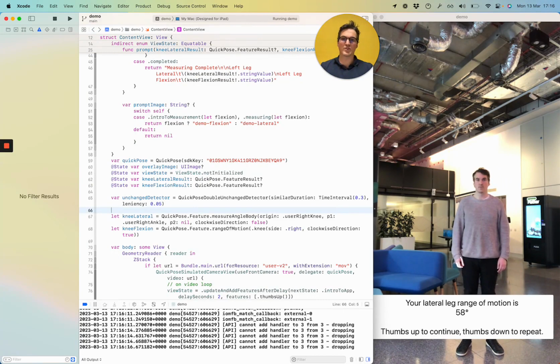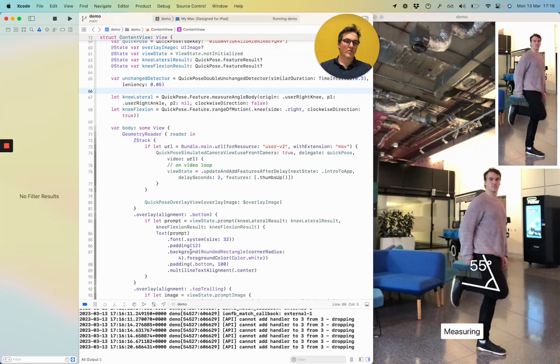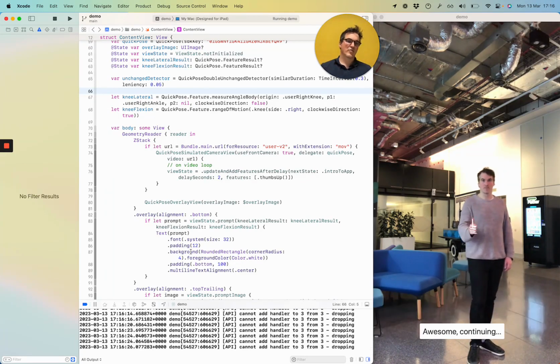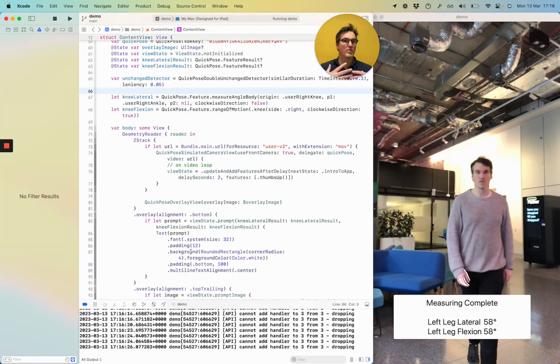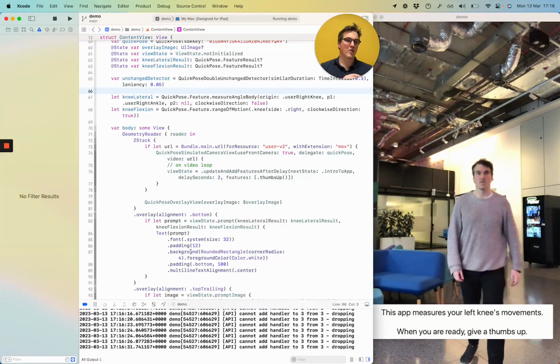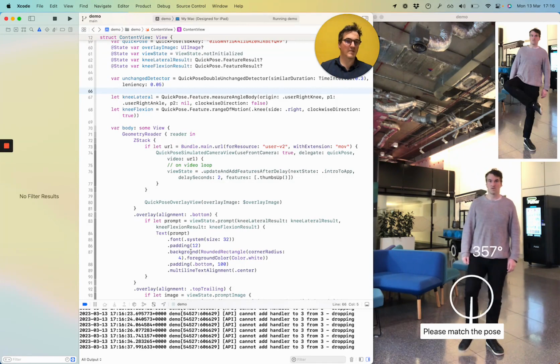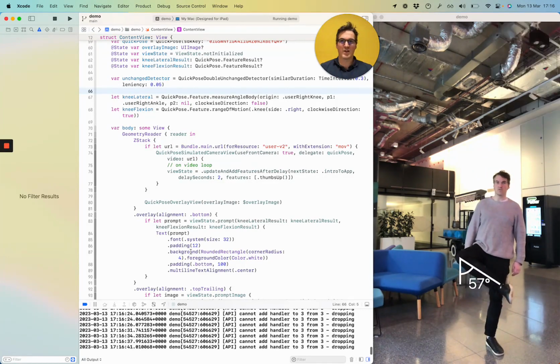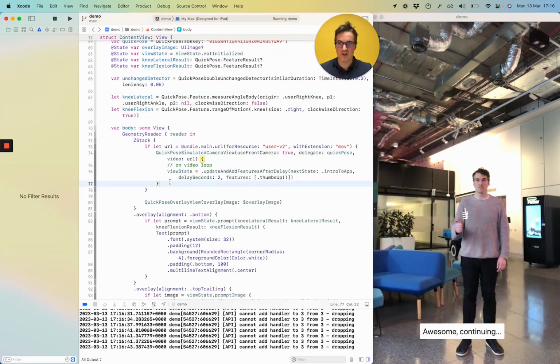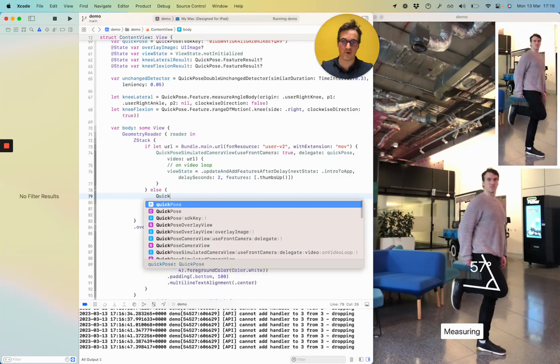So what I suggest now is to record a few unhappy paths. You don't need to test different ranges of motion. That's what we've done for you. What I would suggest though is the user experience. So try this out on a few family and friends. Pass it to the team. We're using the front camera. Well, we've not actually specified the camera here, but a key productionizing step here would be to add your camera.